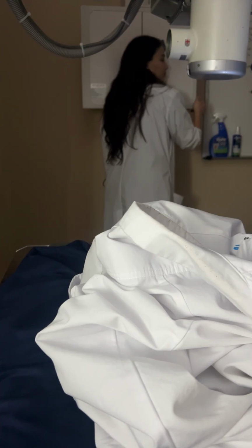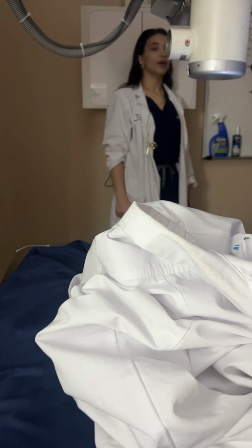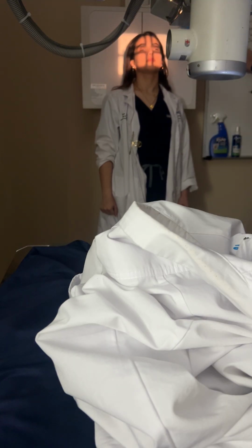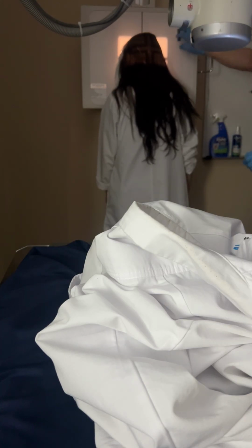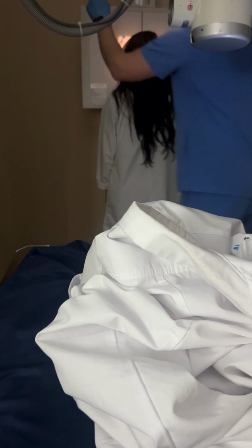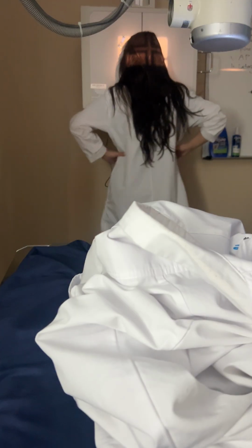Okay, let's look at... You can relax, Nora. PA Caldwell for facial bones. Let me have you turn around again. Oh wait, I was saying lateral for the other one. How much angulation for a PA Caldwell for the facial bones? 15 degrees caudad. Really easy, right?